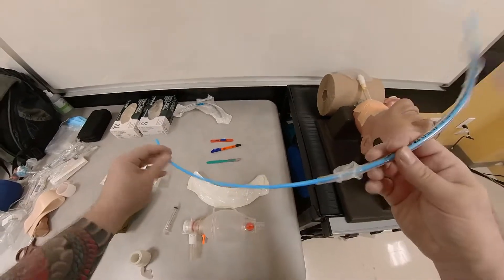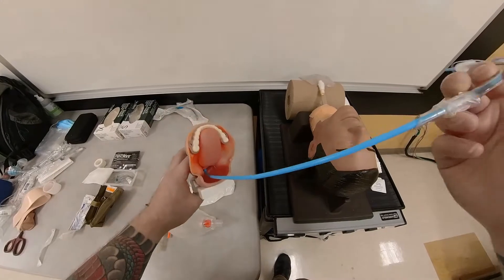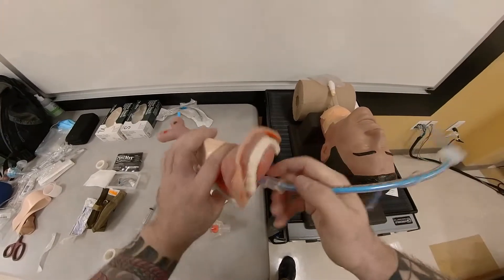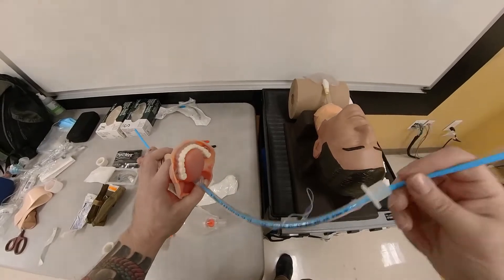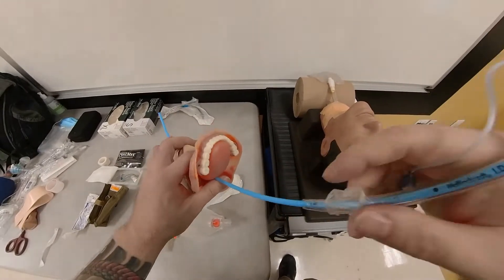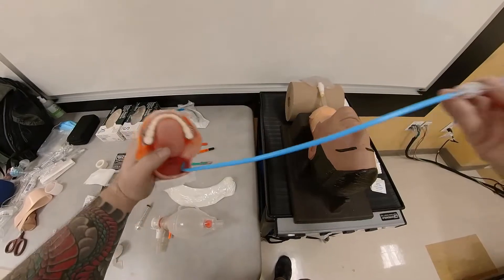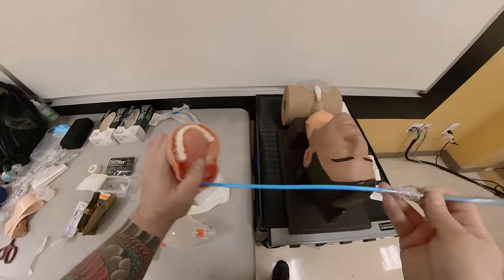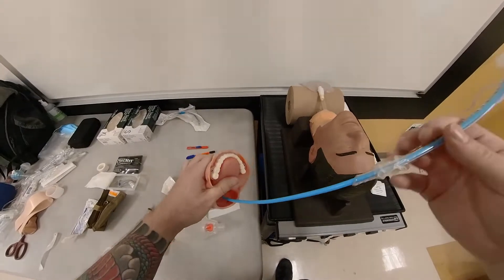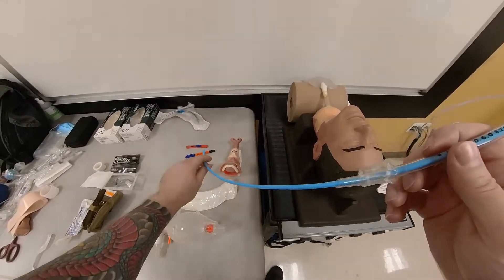Why do you use a gum bougie? It will facilitate the advancement of the tube in the correct location. One way to know you're in the trachea is by getting holdup. If I'm in the correct location in the trachea, holdup usually occurs — it goes into the right mainstem bronchus and will stop. You cannot advance it any further, because you've reached the terminal airways. But you don't want to jam this in very forcefully, as you may cause trauma to the airway. If you inadvertently place it in the esophagus, it will keep advancing all the way down with no resistance — right through the esophageal sphincter and into the stomach. So the gum bougie acts as a rigid stylet and confirms correct location via holdup.